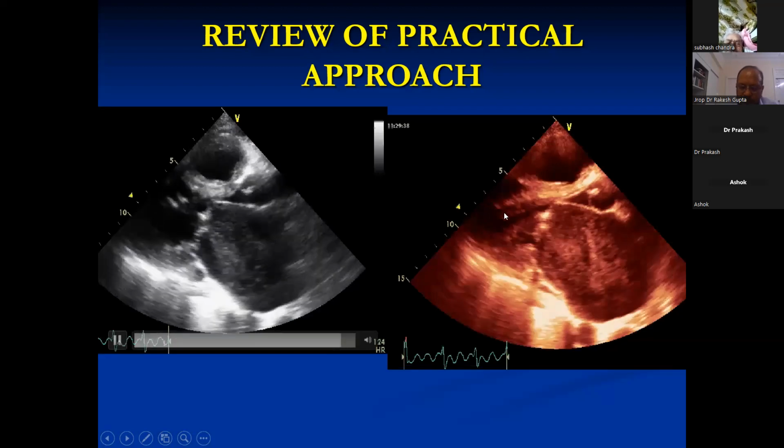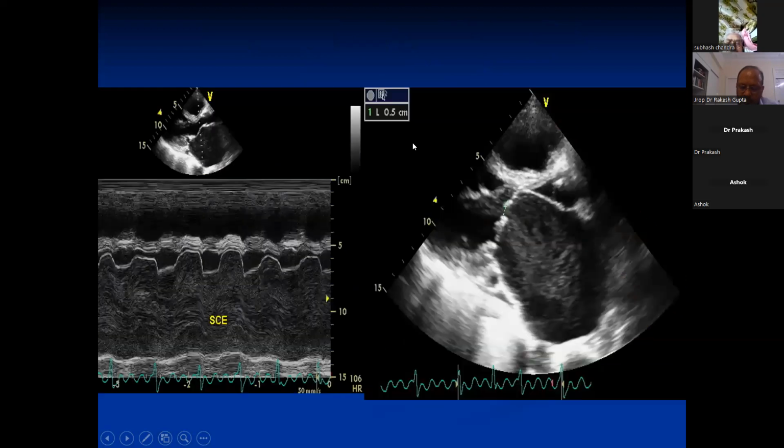Here you see what is known as a separation index. You take this between anterior and posterior, 0.5, which indicates a severe one. More than 10 to 12 indicates a mild one. Just for demonstration's sake, we have put an M mode on the LA to show how a spontaneous contrast echo looks like. So these are the 3-4 things you see: thickening of the leaflet or calcification, doming of the cusp, the difference between the two cusps, the left atrial contrast echo, and any thrombus.